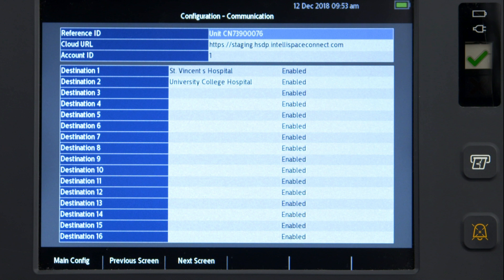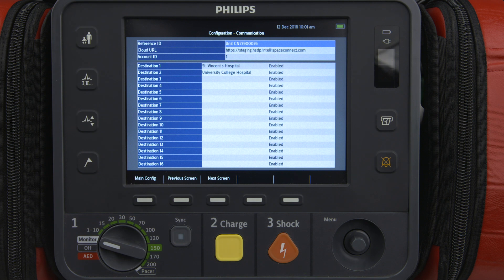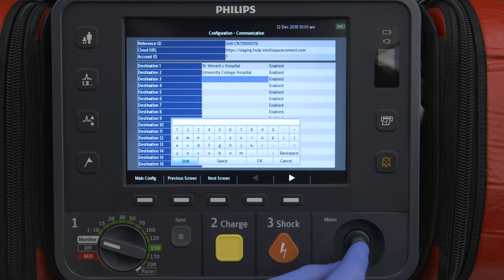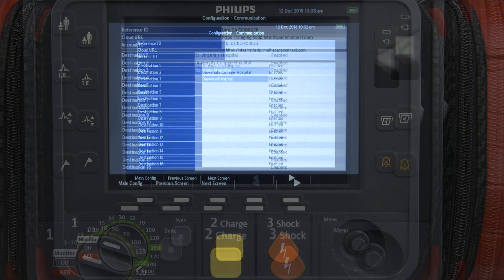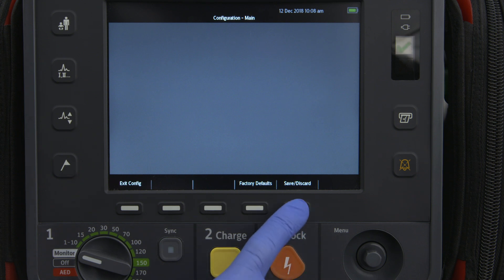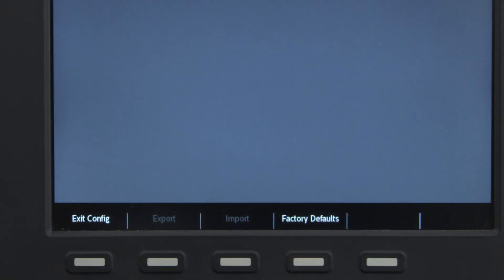You can optionally enter one or more destinations using the Smart Select knob. To add a destination, highlight and select a new field — an on-screen keyboard appears. Use the Smart Select knob to highlight and select each letter, then highlight and select done when finished. When you have completed your configuration choices, press the main configuration soft key, then the Save-Discard soft key, and in the pop-up menu press Save. Enter your configuration password, press OK, then exit Config.